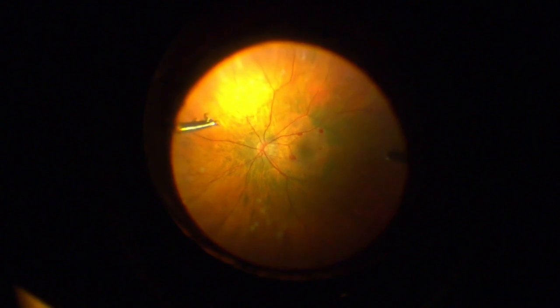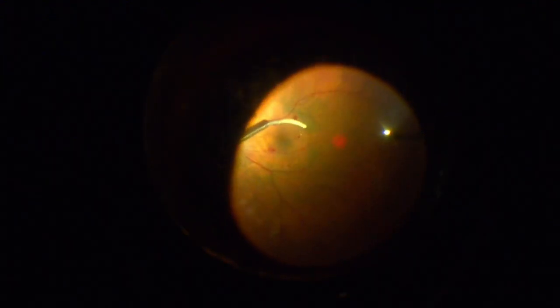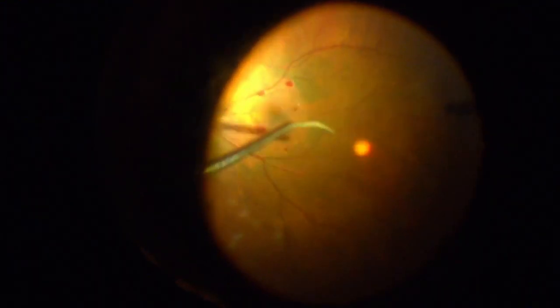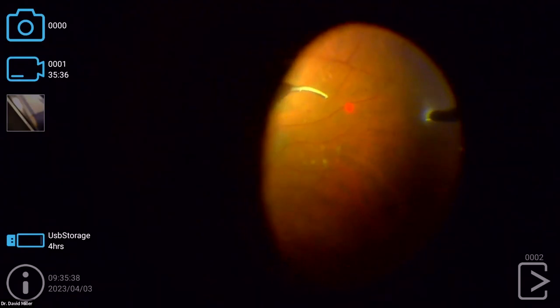We switch hands here. We use an extendable laser, by the way. You can see how that's a nice curve on there. And I'm going to, we can focus that a little bit. And I do care a little bit more about the laser and the temporal macula and the temporal periphery. It seems like that's a hot spot for retinal ischemia on all the angiograms, even without running it. And I think this is a major contributor to her diabetic retinopathy and DME.